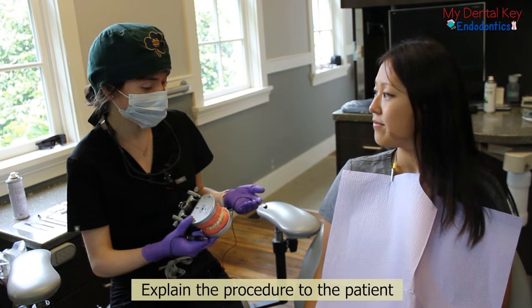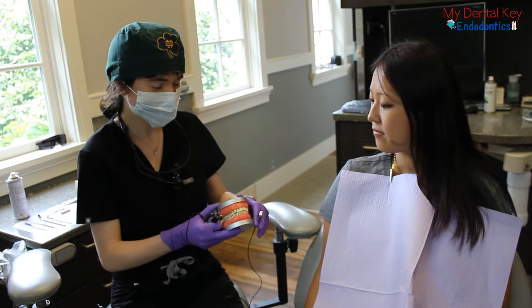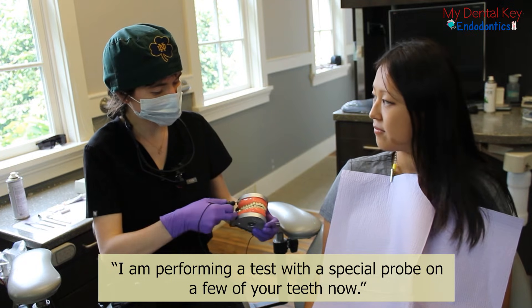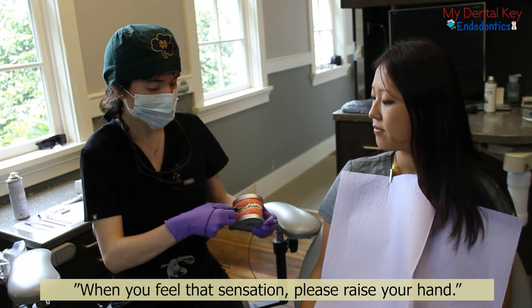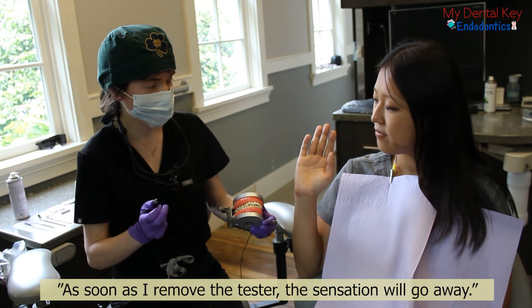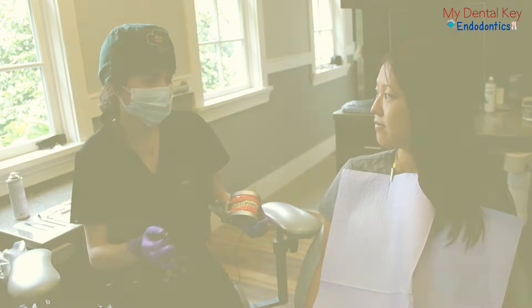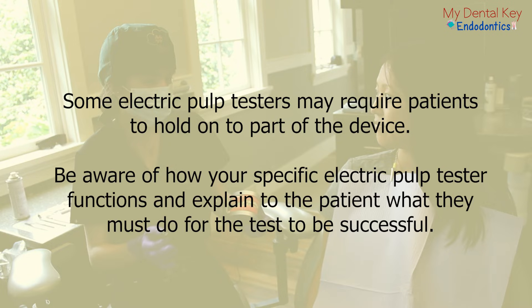Explain the procedure to your patient. Their participation is necessary for accurate interpretation of results. For example, you might say: 'I am performing a test with this special probe on a few of your teeth now. You may eventually feel a tingling sensation on that tooth. When you feel that sensation, I want you to raise your hand. As soon as I remove the tester, the sensation will go away. Do you have any questions?' As a note, some electric pulp testers may require the patient to hold on to part of the device. Be aware of how your electric pulp tester functions, and explain to the patient what they must do for the test to be successful.